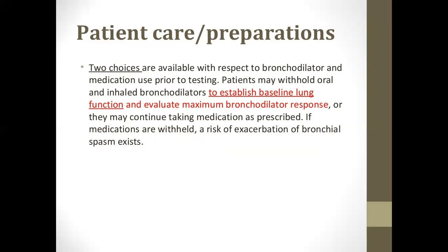Patients may withhold oral and inhaled bronchodilators to establish baseline lung function and evaluate maximum bronchodilator response, or they may continue taking medication as prescribed. If medications are withheld, a risk of exacerbation of bronchial spasm exists.